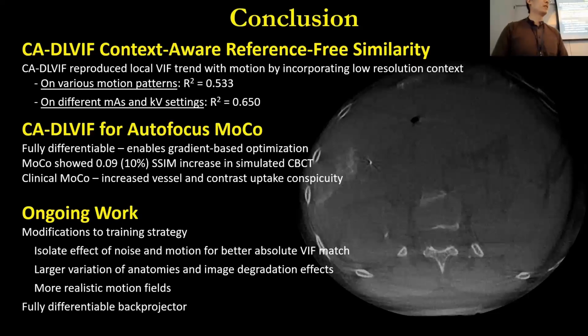That's definitely something we can work on. Currently we are using some assumptions about locally rigid motion, so we can still use that assumption by assuming some rigid motion inside each ROI. It may not be very realistic, but once we interpolate it into 4D and smooth it out, it hopefully can create a smooth motion vector field. So the point here is that we just want to avoid the partial angle reconstruction, but we are still using the rigid motion assumptions, so that hopefully that can take care of the non-differentiability of the motions inside the clinical data.